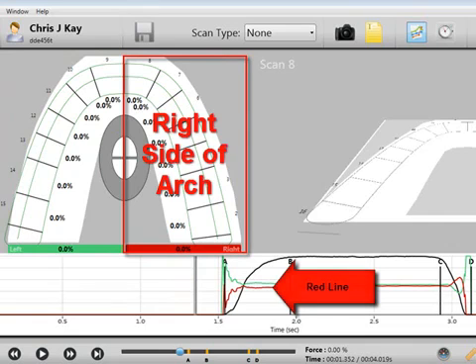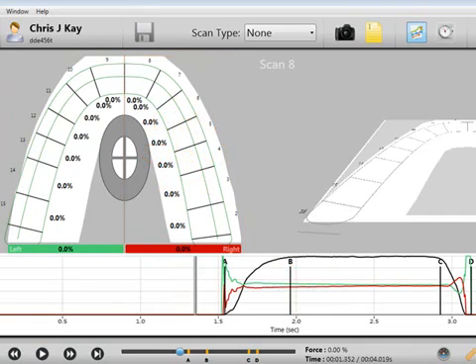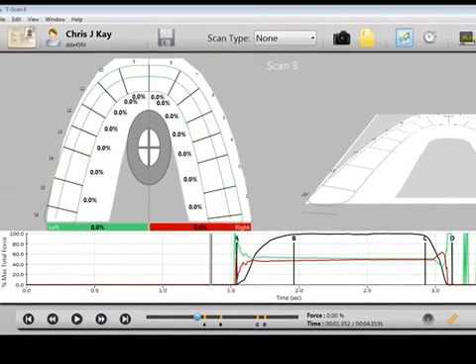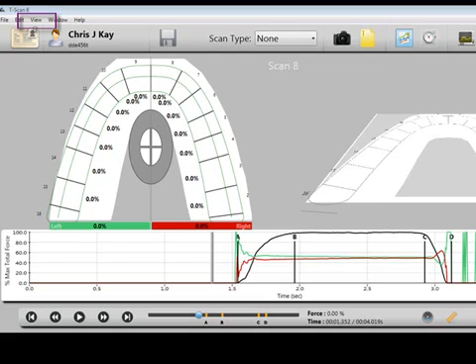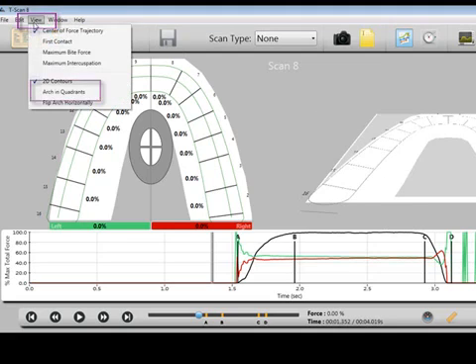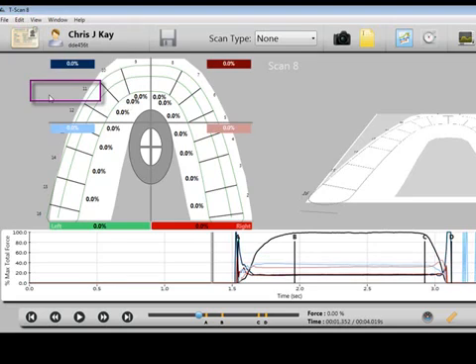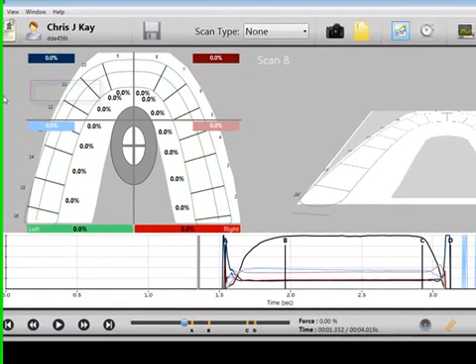In addition, the arch may be divided into quadrants. This allows for a more detailed look at the distribution of forces around the arch. To add quadrants, select View, then Arch in Quadrants.